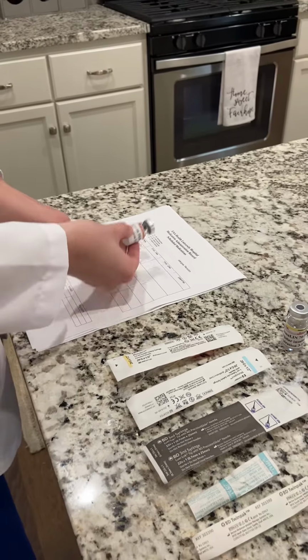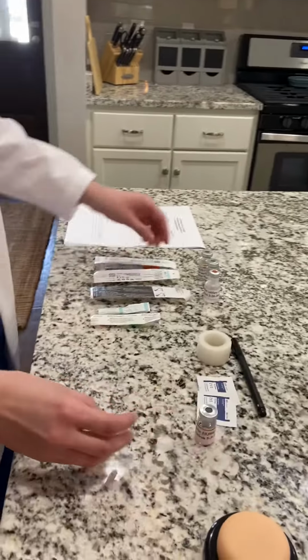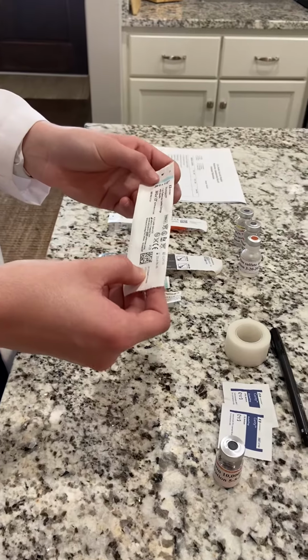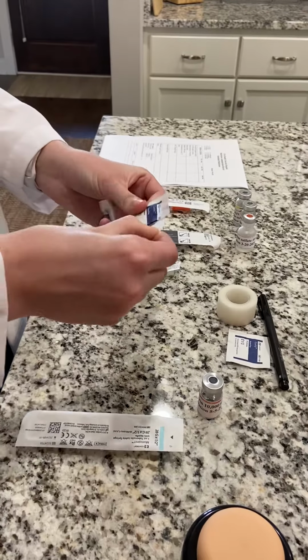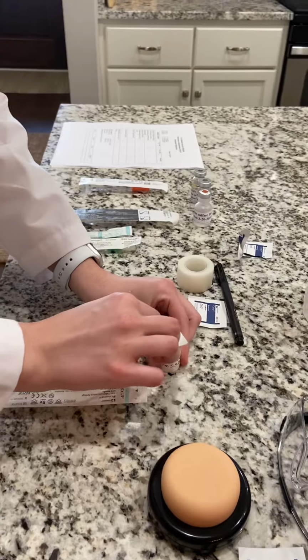today. So now I'm going to come over here to prepare my medication, and I'm going to pick the correct syringe. The syringe I'm going to pick today is the 1 milliliter tuberculin safety syringe. So now I'm going to prepare to take my medication. Come over here, I'm going to clean the top of the vial.